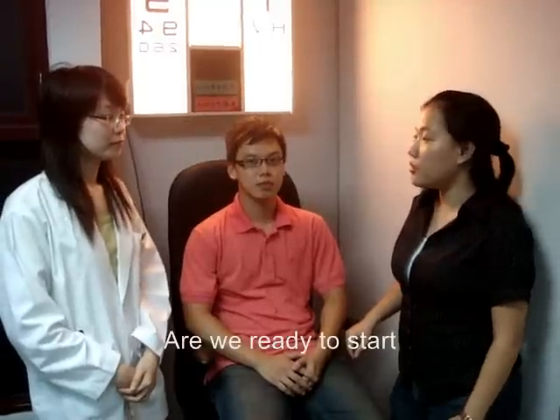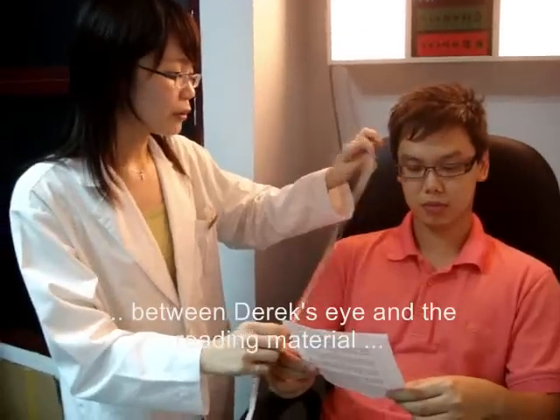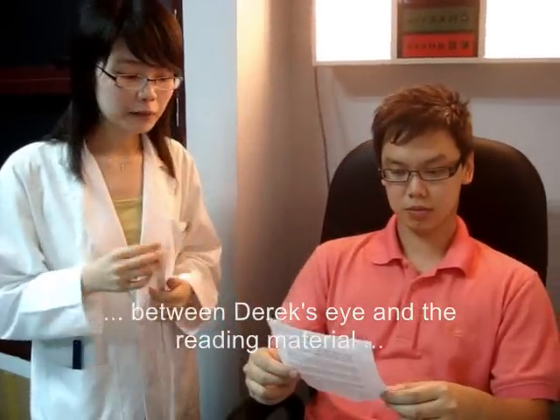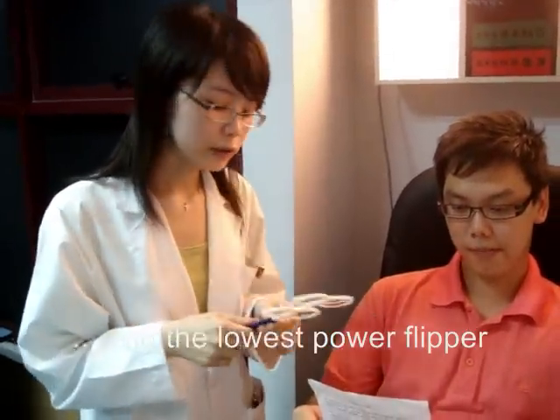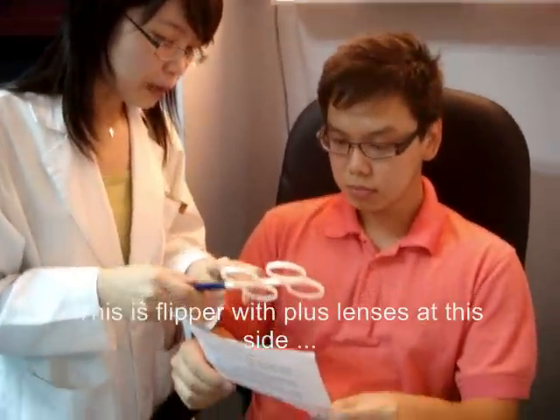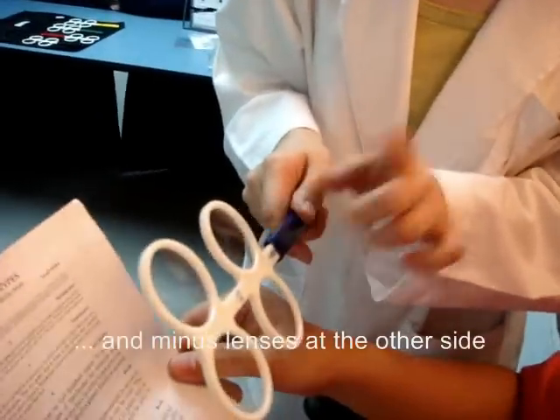Are you ready to start? How does it work? Derek, I want you to hold this. We will begin with a working distance of 40 centimeters from Derek's eyes to the reading material — the reading chart. We will start using the lowest power flipper. So Derek, this is the plus lens on this side and the minus lens on the other side.